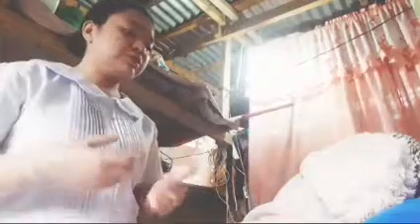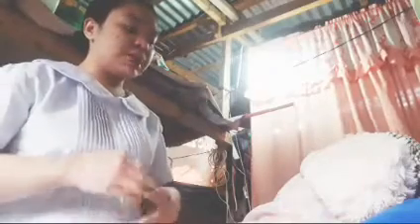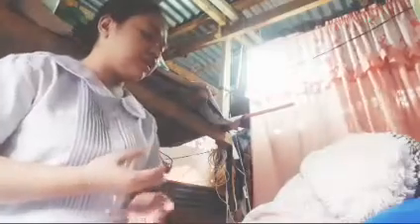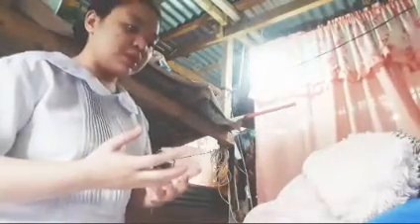Good morning, ma'am. I am Marisa Pulga, and I am your student nurse for today. Before starting, may I know your name? Okay, Ma'am. For today, I'll be changing your IV fluid. May I ask first if you are comfortable? Okay, thank you. IV fluids are specially formulated liquids that are injected into the vein to prevent or treat dehydration. I am explaining the procedure and the purpose of this to the client.